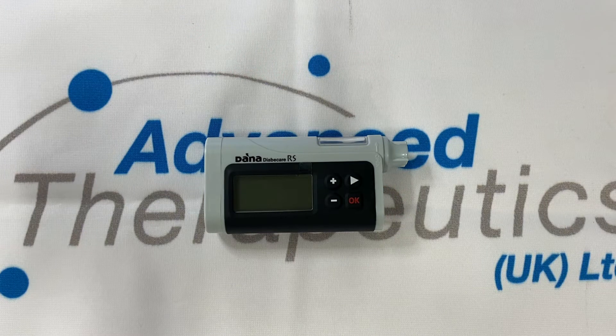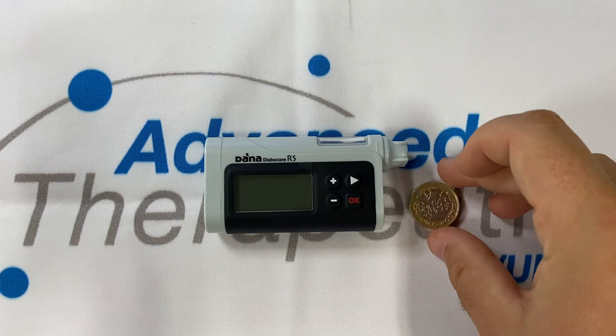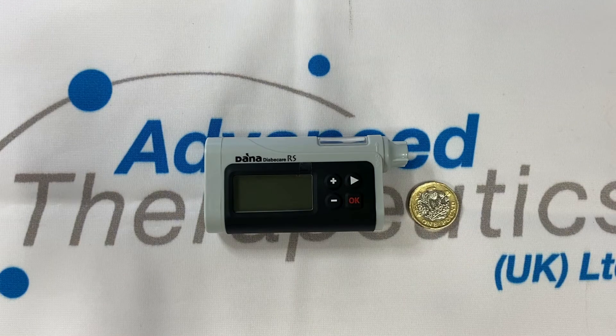Hi, allow me to introduce the Dana RS Insulin Pump. Offered in the UK by Advanced Therapeutics UK Limited, the Dana RS Insulin Pump is incredibly small and incredibly light, weighing in at only 62 grams including the battery.